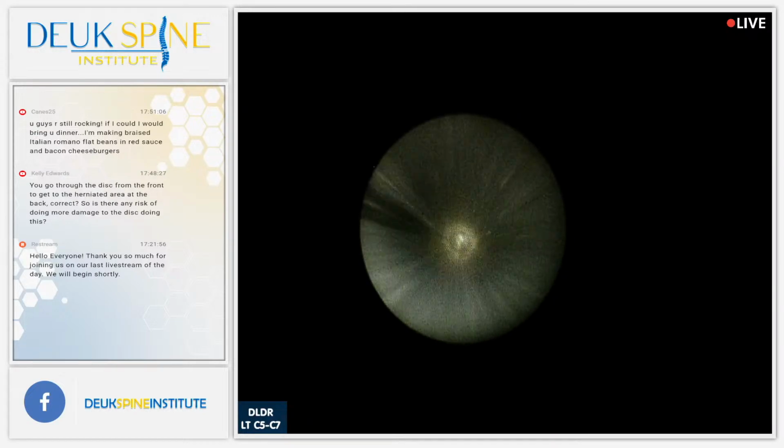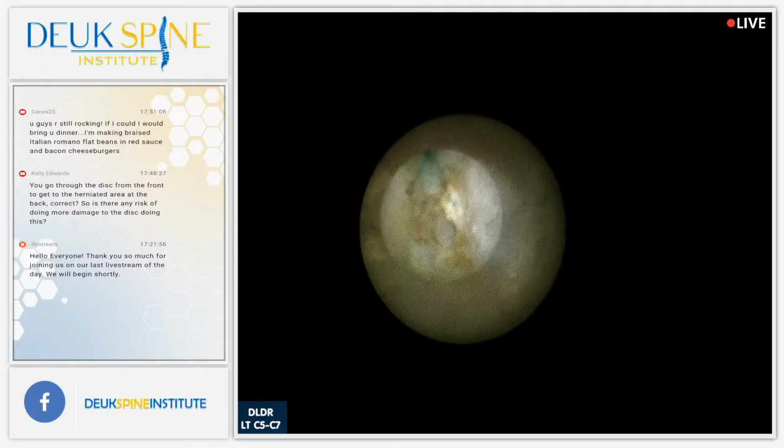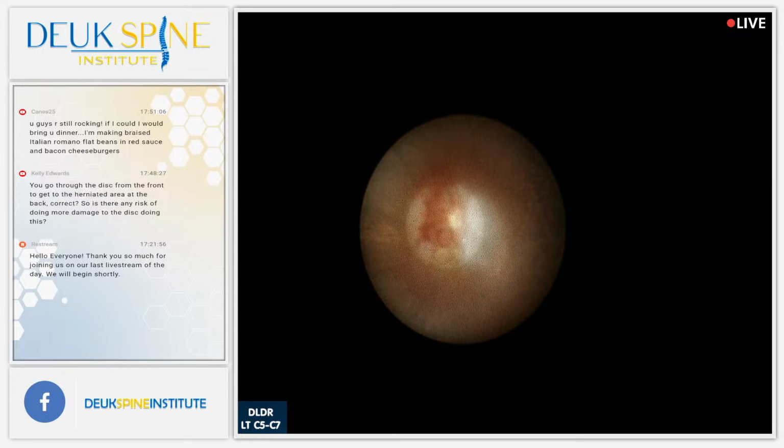All right, so the laser fiber just broke. I'm going to have to get a new one. Just turned off the irrigation. That's what happens when we turn off the irrigation. I'll turn it back on.